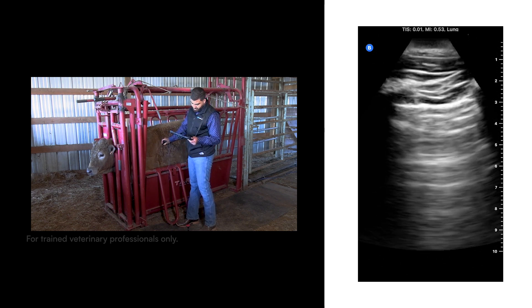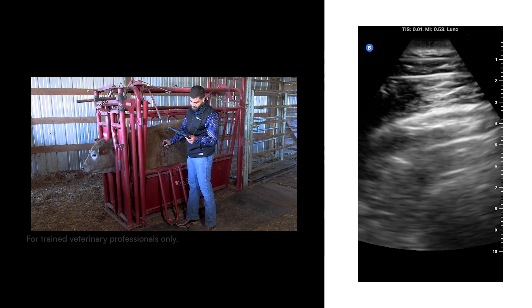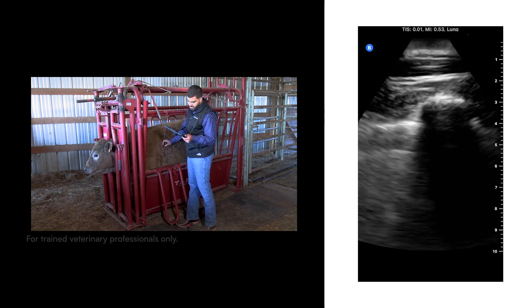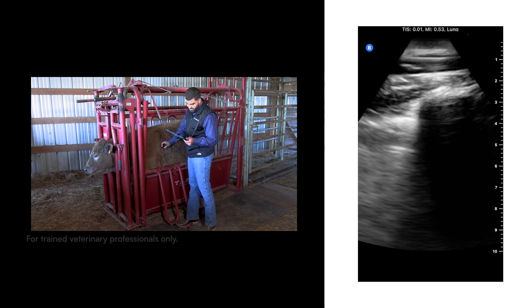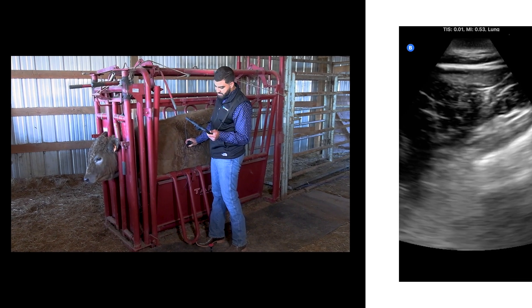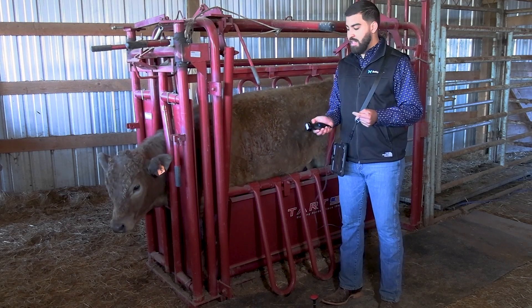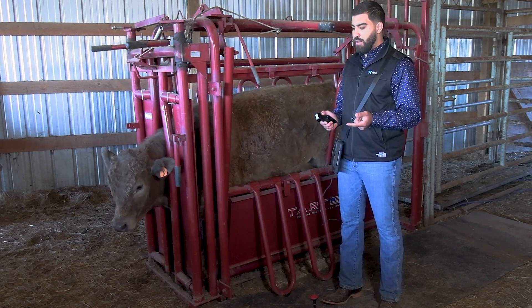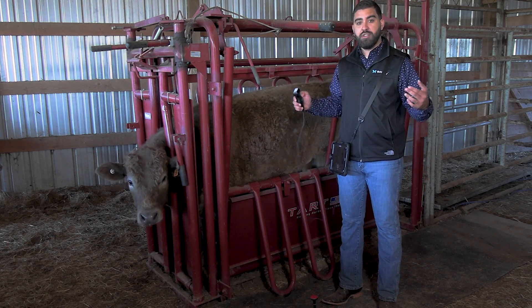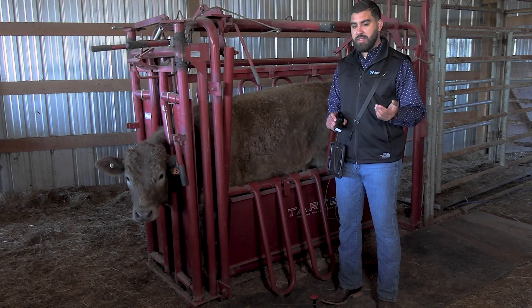Another thing we can evaluate with lung ultrasound is pleural effusion. When we look at the pleural line — that first bright line at the top of the image — if there is a very dark space in between, that indicates liquid is present. That's called pleural effusion, and it's pretty obvious when it's there. When an animal has liquid around the lungs, the lungs cannot expand the way they should. So a case with effusion is a little more complicated compared to a case without effusion.